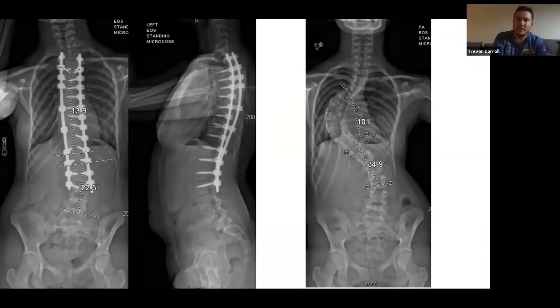And so then this is the lady from earlier. Got her down pretty well corrected. So screws in on the left side all the way, right side you use to push down, balance those shoulders. And she still has a small residual curve down at the bottom, but we've left her with three motion segments. So a little bit of a curve down there, I think is probably just fine.